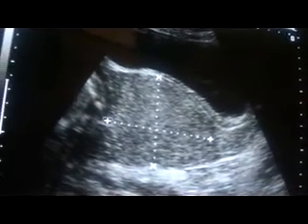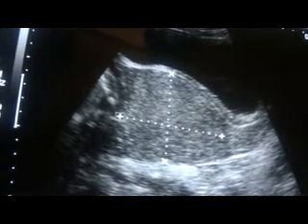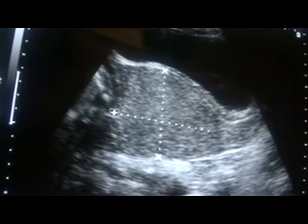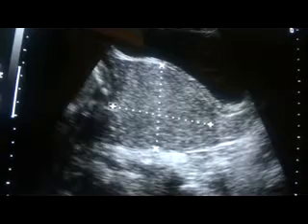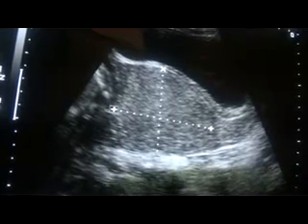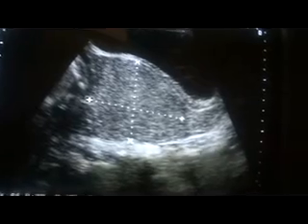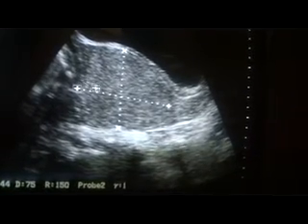To my mind, there are two differentials. Either this is a bleed or this is a fibroid. Anyone who is seeing this video, I request you to comment and let me know if you have any other suggestions, for my learning purpose.